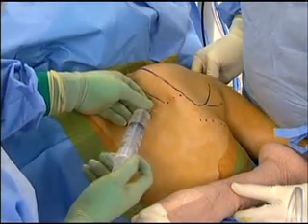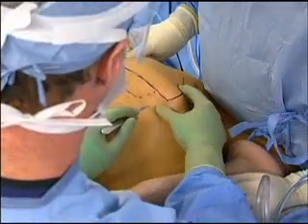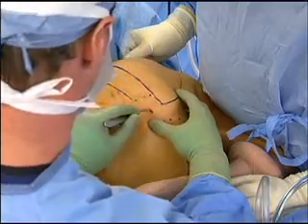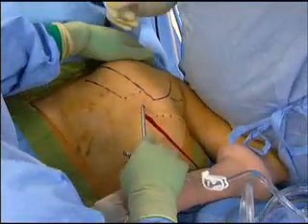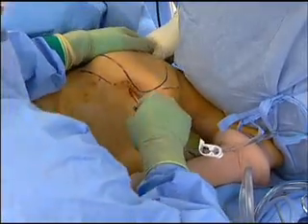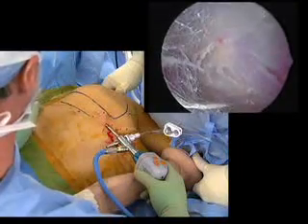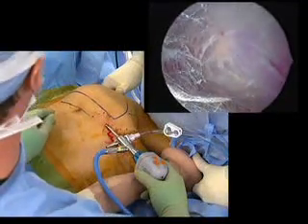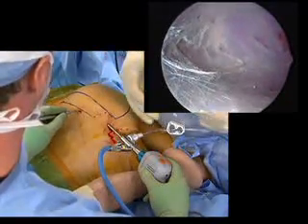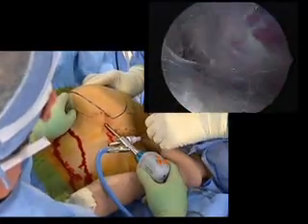Approximately 100 cc's of normal saline with Marcaine and epinephrine is used to distend the scapulothoracic joint and for hemostasis. This allows for safer introduction of the arthroscopic instruments. First, a portal is established at the inferior medial angle and a 4 mm 30-degree scope is inserted. A diagnostic arthroscopy is performed. Extensive severe scapulothoracic bursitis was noted in this case. There was also evidence of bony impingement at the supromedial angle of the scapula.